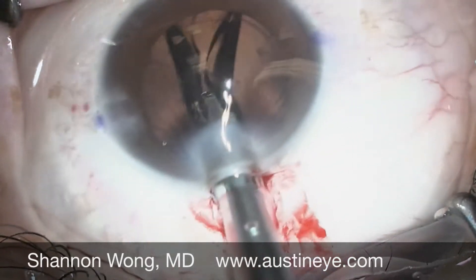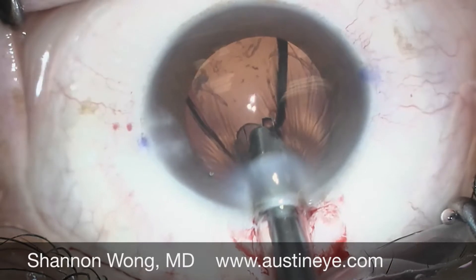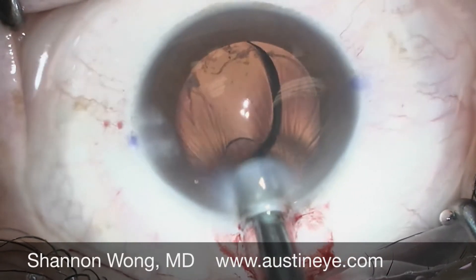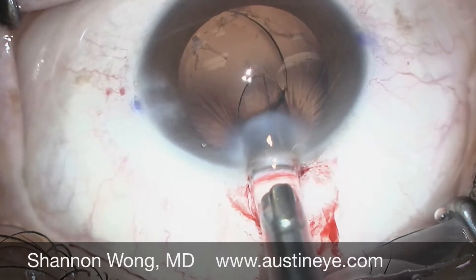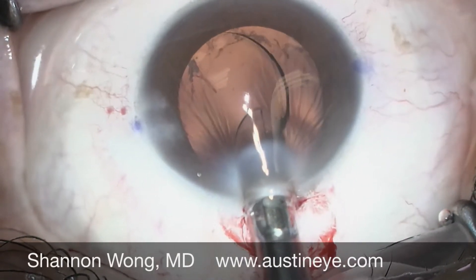The trailing haptic is now in the eye, but the top of the trailing haptic is on top of the insertion tip. The insertion tip incarcerates the trailing haptic between the cartridge and the metal insertion tip, and it amputates the trailing haptic.